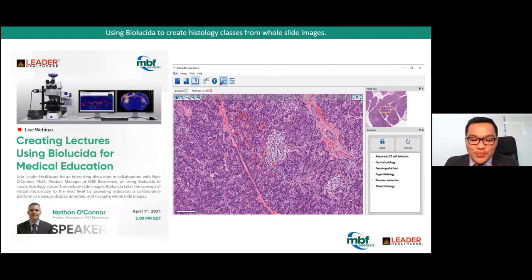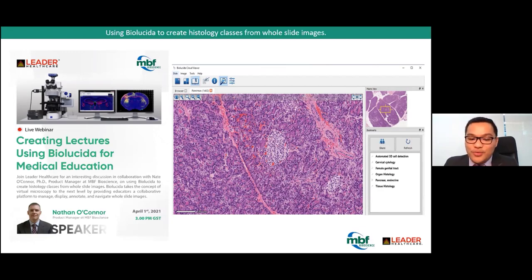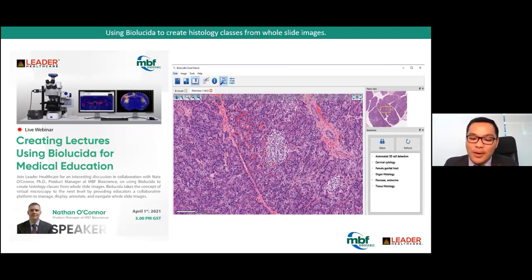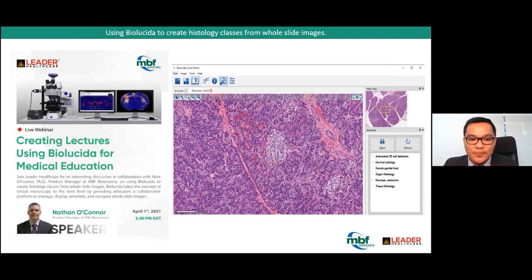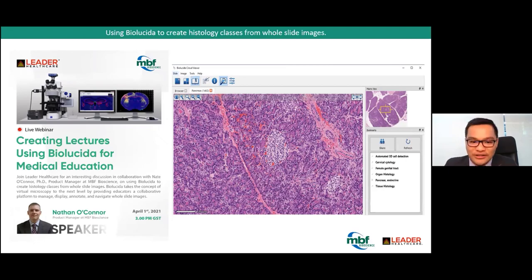We are excited to present BioLucida to enrich your medical education course. It is an interactive learning management software developed in collaboration with leading medical educators across the globe. BioLucida takes virtual microscopy to the next level by providing educators a collaborative platform to manage, display, annotate, and navigate whole slide images, reaching hundreds of users simultaneously with dynamic and rich content.